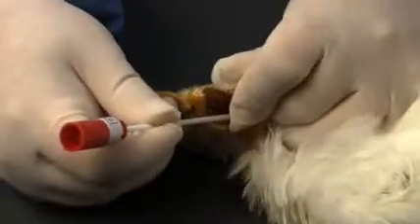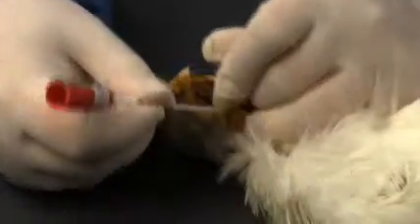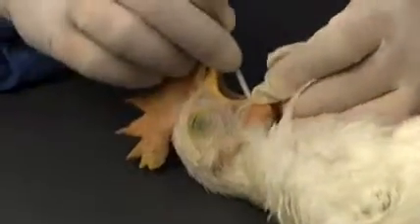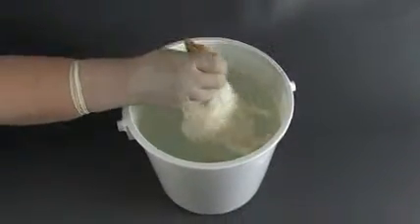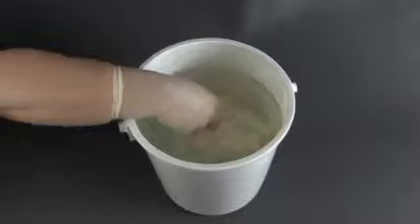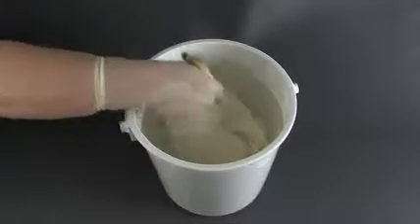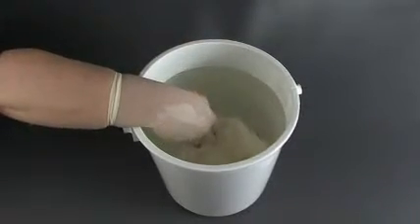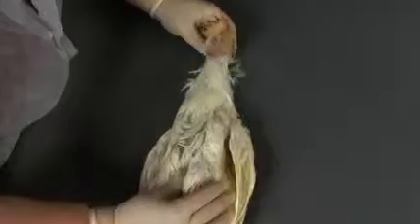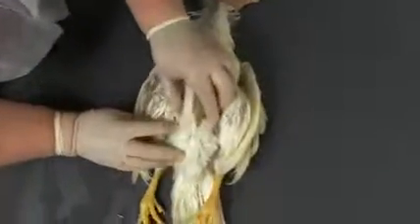Once the external exam is completed, collect any necessary diagnostic samples for laboratory testing. Then, dip the bird from the neck down in a disinfectant solution. Wetting the feathers reduces the aerosolization of pathogens and makes it easier to evaluate the skin and other external structures. With the feathers wet, perform a quick reassessment of all the external features to ensure that no lesions were overlooked during the dry exam.